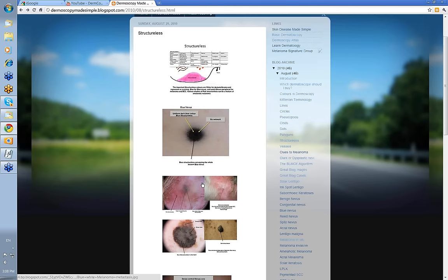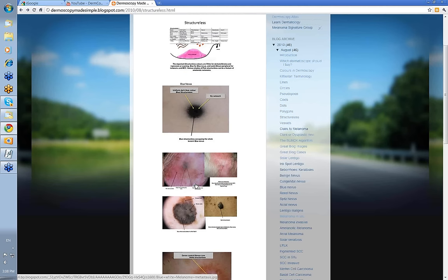What other blue ones do we have? We've talked of BCC, and we've talked that melanoma may be blue as well.